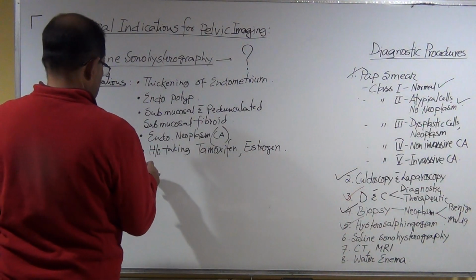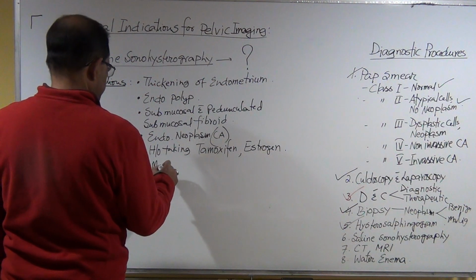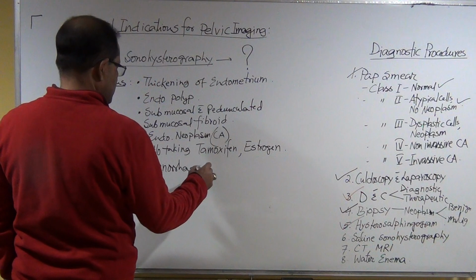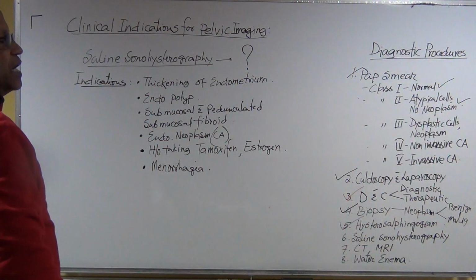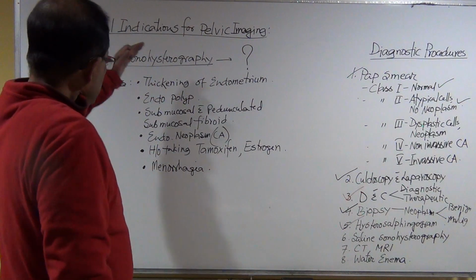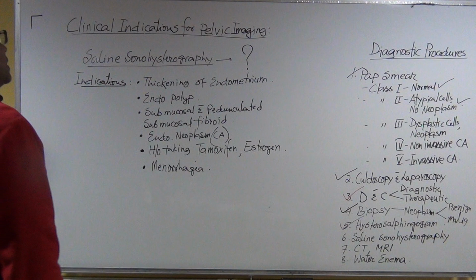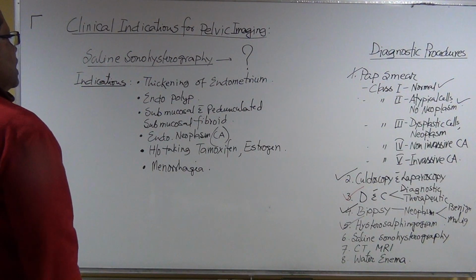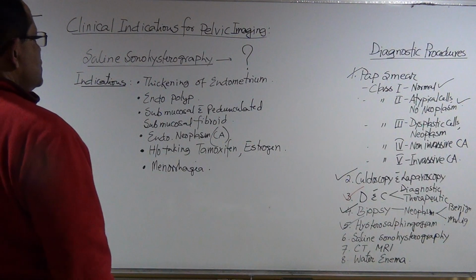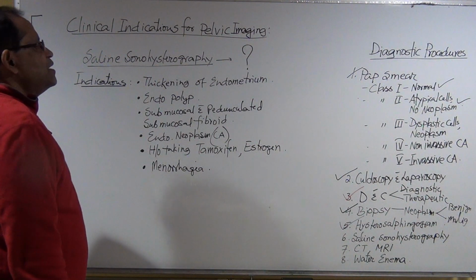Okay, there might be menorrhagia. Menorrhagia, too much bleeding. Okay, so these are the indications of the saline sonohysterography.